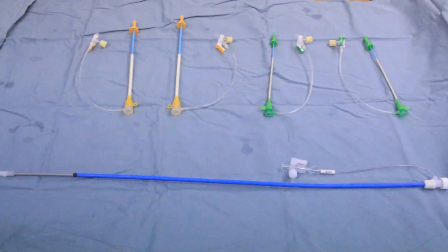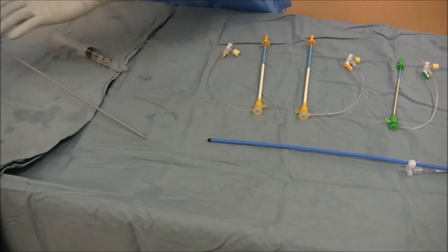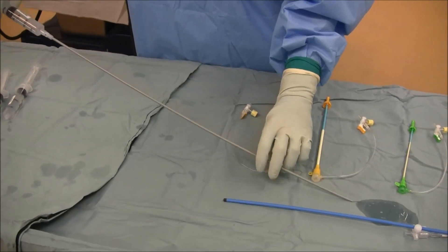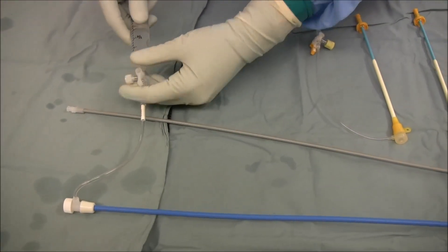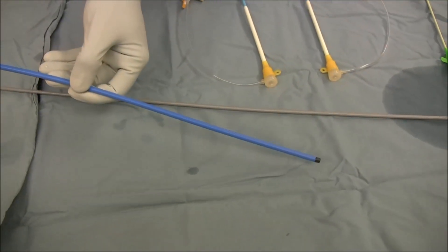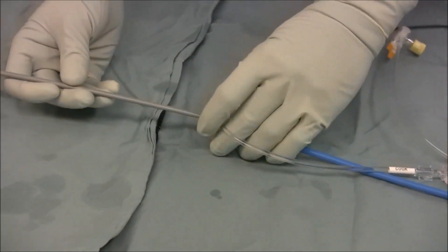The fourth step is to flush three sets of sheaths. There are two 6 French, two 11 French, and one long 12 French sheath. The dilator is removed and flushed with heparinized saline. The sheath is flushed by opening the stopcock, flushing with heparinized saline, and then turning the stopcock toward the flush port — it is critical to remember this step. The dilator is then carefully reinserted into the sheath.